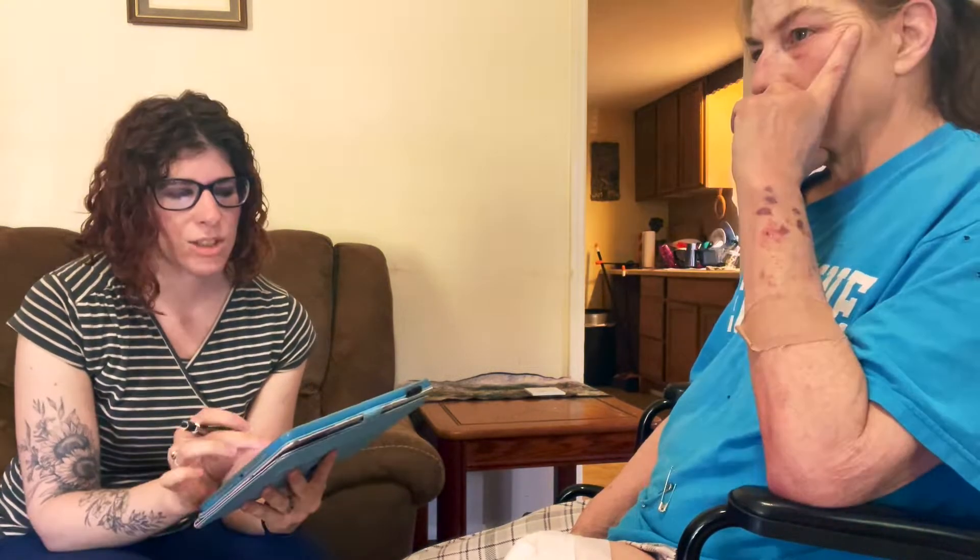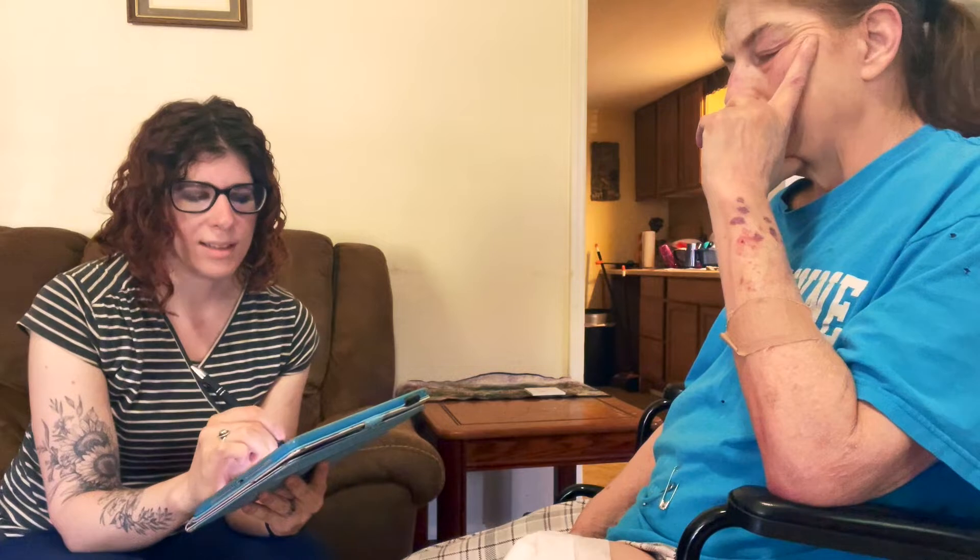We are here and we are going to be doing just a quick eval and casting for a left transfemoral prosthesis. So about how far out are you from amputation surgery? Do you remember the date, or a rough estimate? They amputated it in May. I can't remember the date. I was septic because of the infection and a week went by without me remembering anything. I don't remember it.